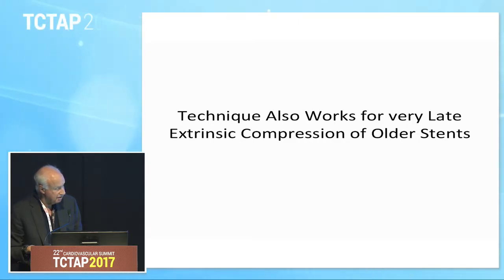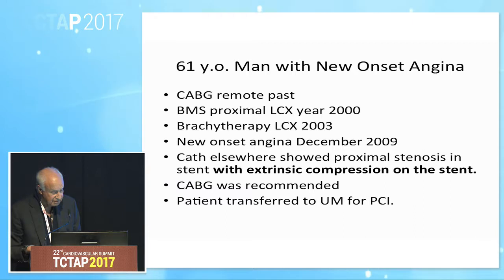Patients who have stents, especially in the proximal portion of the circumflex artery, who have had stents in for 5, 10, or 15 years, develop calcification around the area, and that can compress the older stent. This is a 61-year-old man who had a bare metal stent in 2000, brachytherapy in 2003, and was free of all symptoms until 2009, when he came back with both in-stent and extra-stent restenosis.